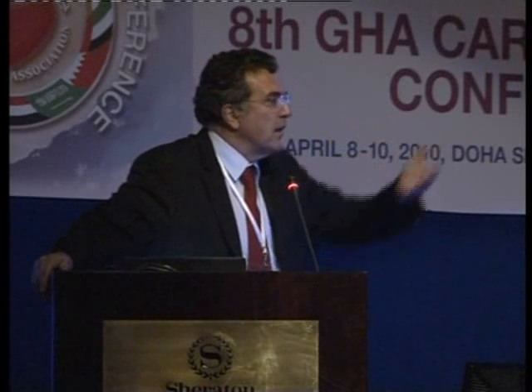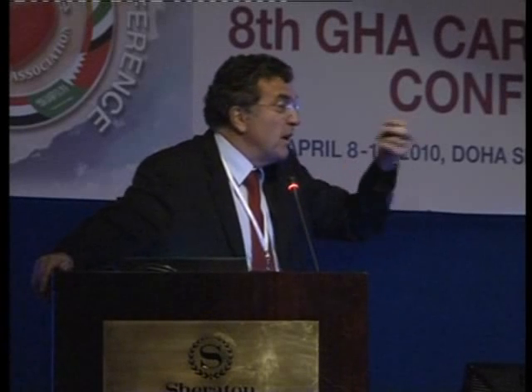The torque of the wire is a little stiffer compared to a conventional wire like a BMW wire, for example. So why take the risk of having the tip of the wire in the critical lesion? For me, I cannot understand that.